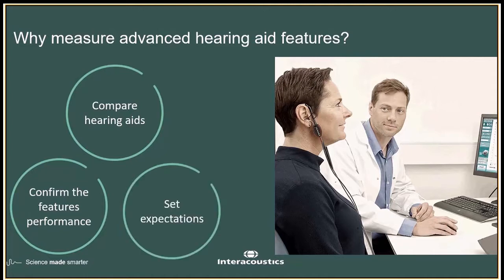We can use it to set expectations. So let's say that we have a patient who is a helicopter pilot. Giving a patient like this a feature which is titled noise reduction, automatically he may have incredibly high expectations that this is going to make his life and working life much easier, and that it will be absolutely silent while he's flying his helicopter. However, that's not always the case, and the way that this is working doesn't typically identify that that's how it's going to be done. So by explaining and showing this, it helps him to understand how his hearing aid should be performing and what limitations it has, so that he uses it better and doesn't come back to return his device or stop using it at all.